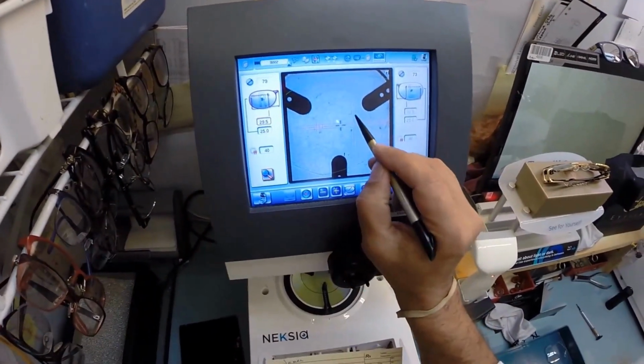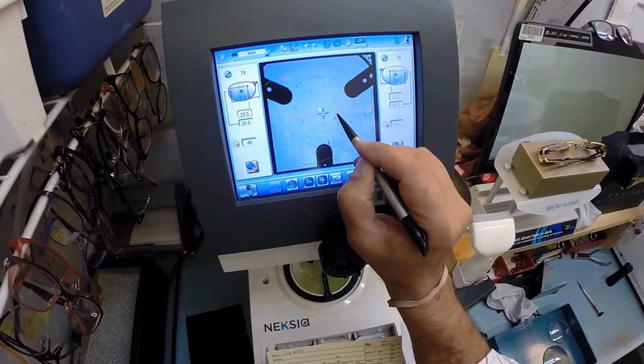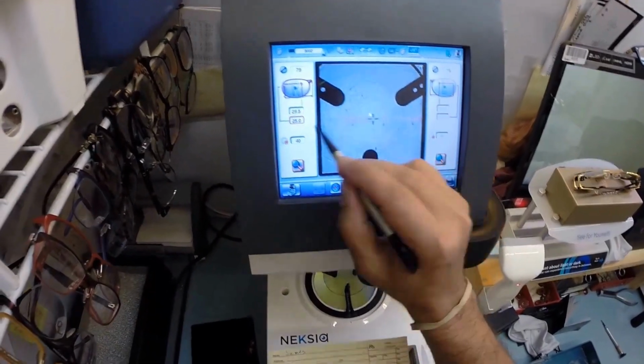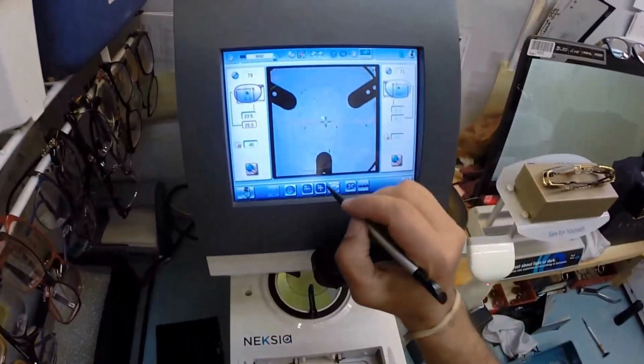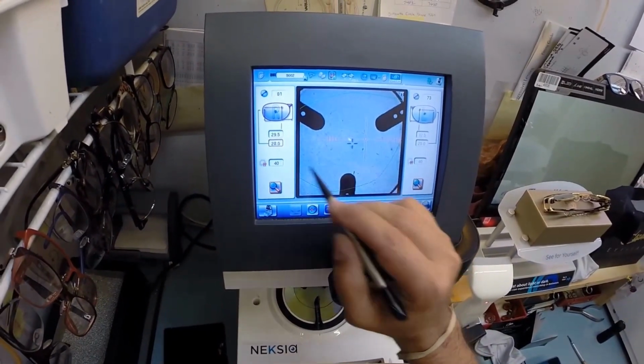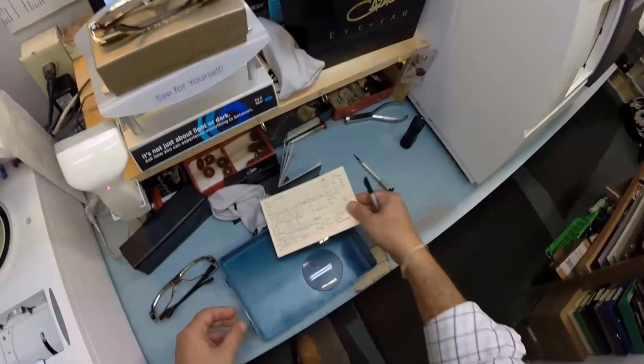The orange cross is where your lenses are going to sit, your optical center. So I want to raise that optical center height from 25 up to 28. I'm going to tap the plus button. It's going to go up in 0.5 millimeter increments until we get to 28.